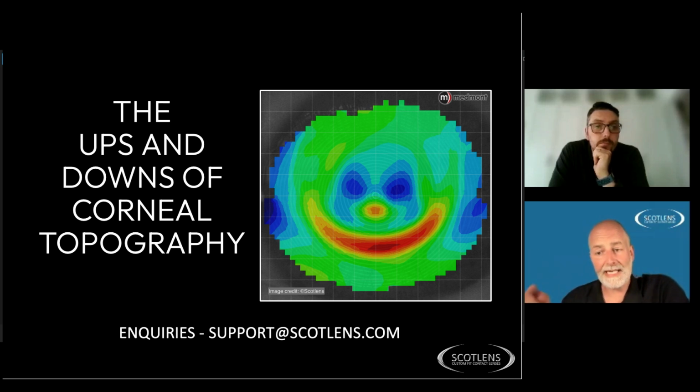But the Pentacam is, again, if you're in a practice where you're going to do a lot of work with laser clinics and your revenue stream is going to come from that, yeah, look at one of those instruments. But if you're looking at the main revenue, my topographer, after my trial frame, brings in the most amount of revenue from the practice from the point of view of specialist contact lens fitting, more than my OCT, more than any other instrument. So if you're going to get your revenue from specialist contact lens fitting, my advice would be buy the topographer that's the best for that, which would be the Medmont.